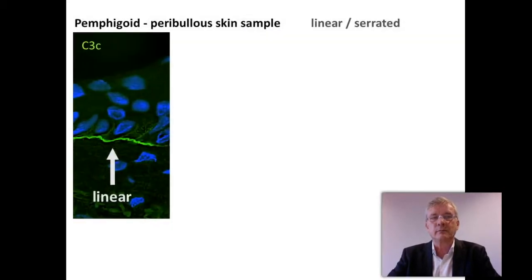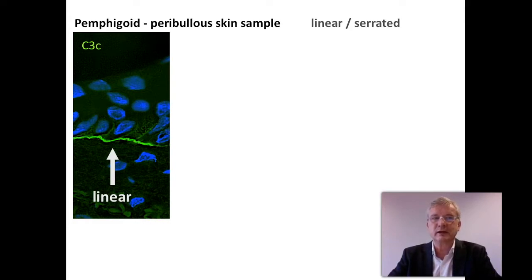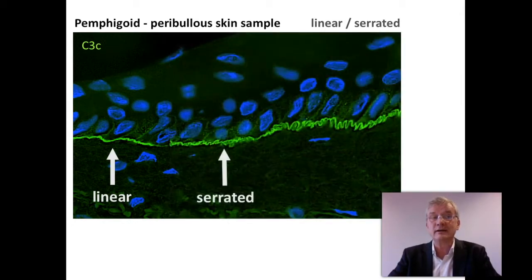Here is an example of a perilesional skin sample of pemphigoid, with at the left side a linear deposition pattern in the epidermal basement membrane zone, and at the right side a serrated deposition pattern.